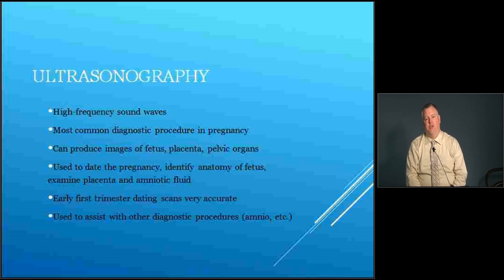And ultrasonography is just the use of high-frequency sound waves. It is the most common diagnostic procedure used during pregnancy, and it's used to produce images of the fetus, placenta, and the pelvic organs. It's used to date the pregnancy, to identify anatomy of the fetus, to examine the placenta, and to examine the amniotic fluid. The scans that are done in the early first trimester are very accurate as far as dating goes. They're also used to assist with other diagnostic procedures like amniocentesis.